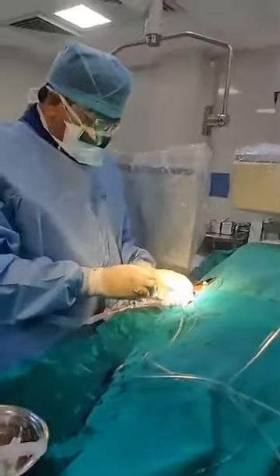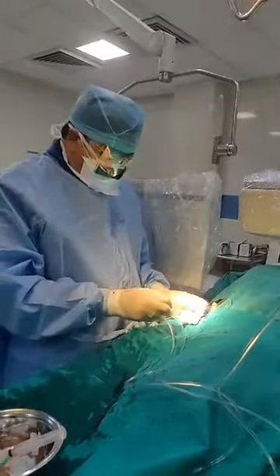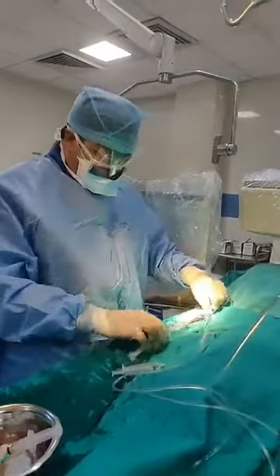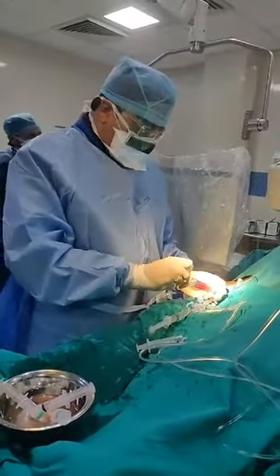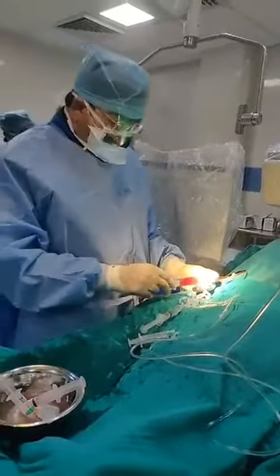And then we will start the procedure of angiography. We check the zero also. This angiography is a procedure where we inject the dye directly into the patient's coronary arteries.